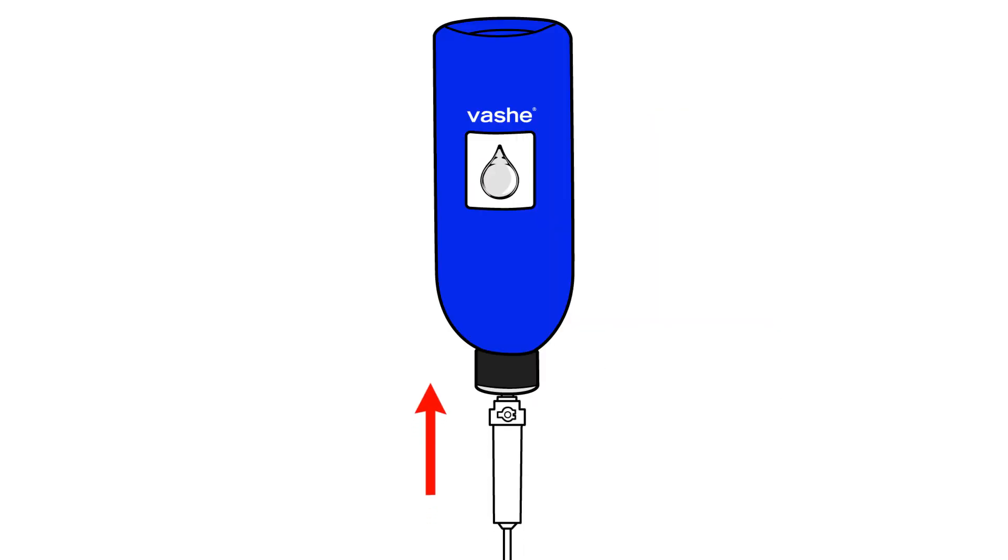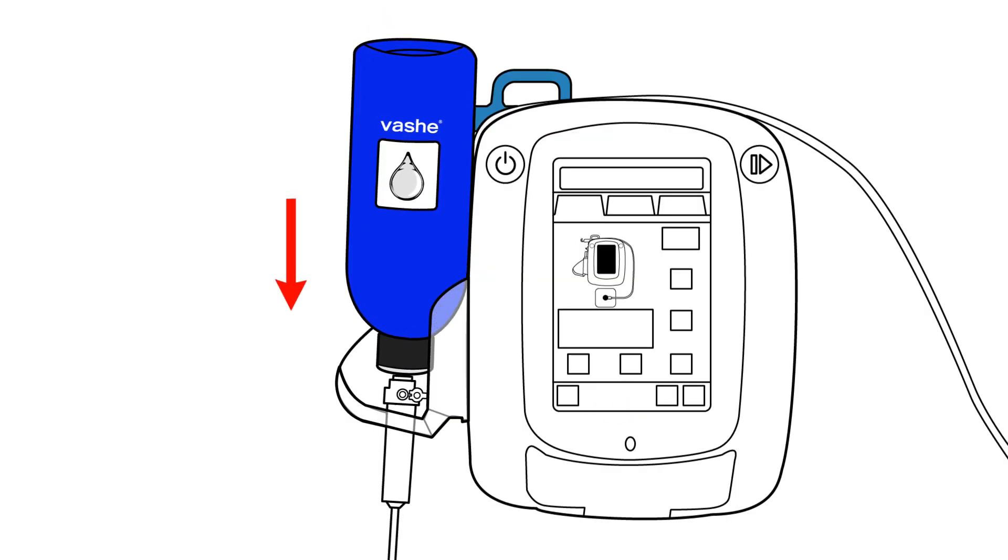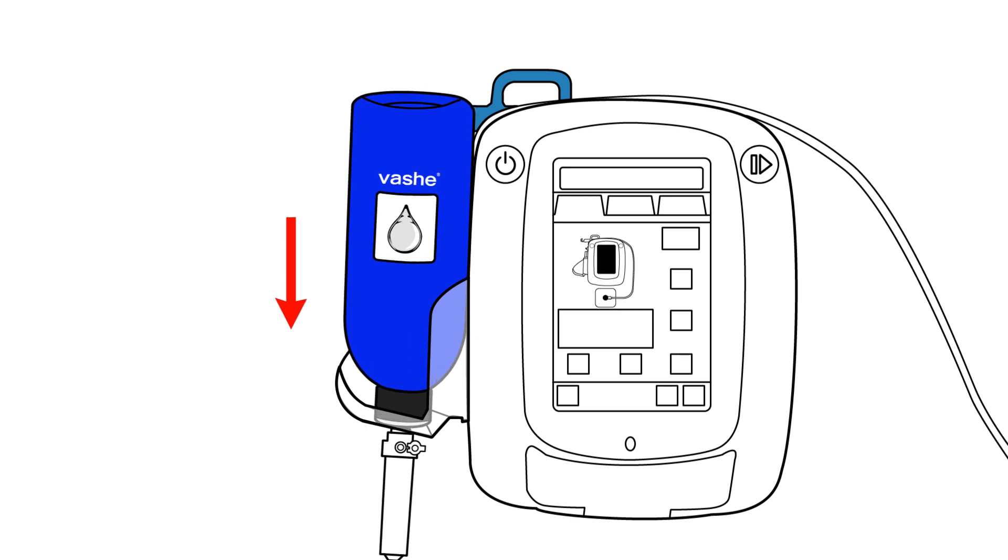Take irrigation tubing and spike Vosh bottle. Open vent to allow airflow. Then place bottle into provided cassette and change as needed.